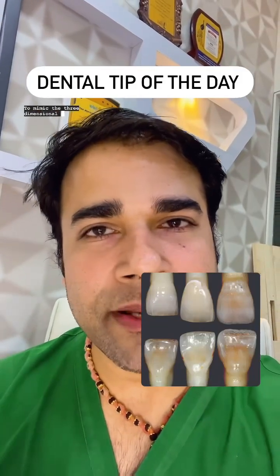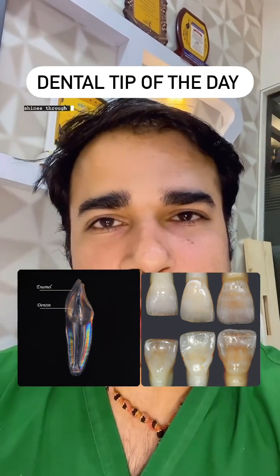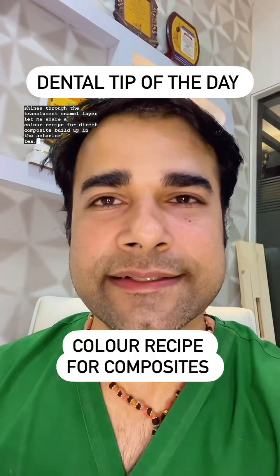To mimic the three-dimensional appearance of natural teeth, where the chroma comes from within the dentinal core and shines through the translucent enamel layer, let me share a color recipe for direct composite build-up in the anterior teeth.